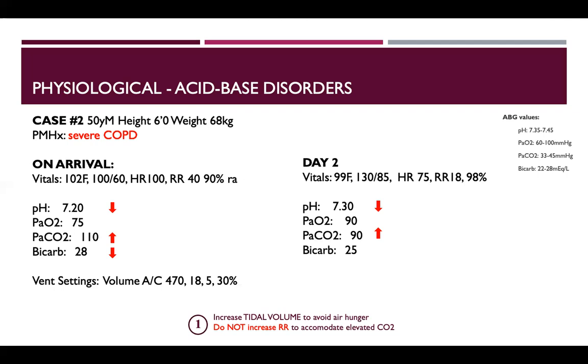Obviously, if they're wheezing, gasping for air, trying to breathe over the vent, those are all other signs that maybe the vent settings aren't good for them. But I'm just talking about this as a preventative measure based on the history that you now know.